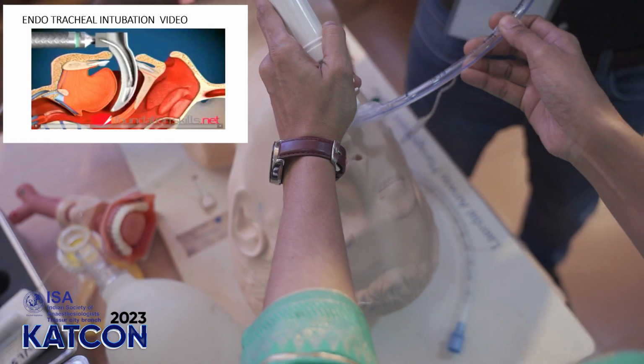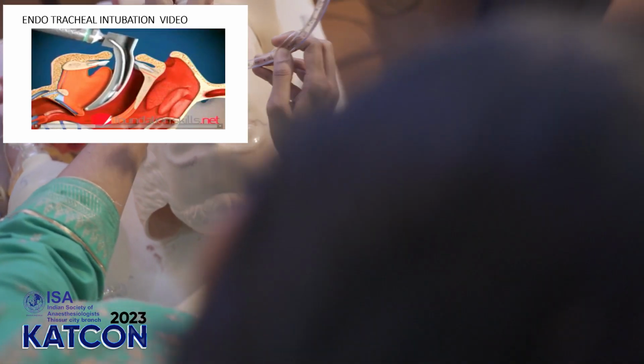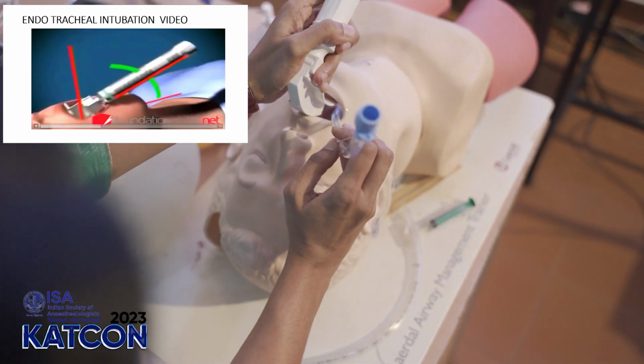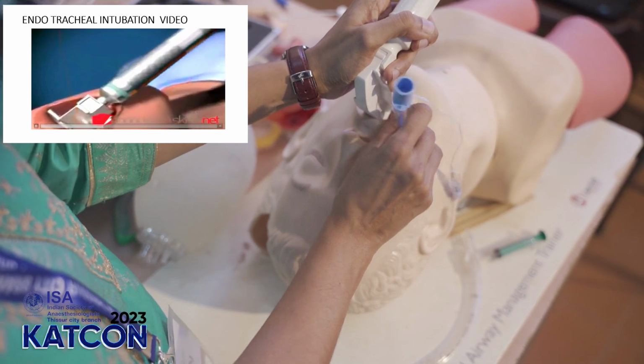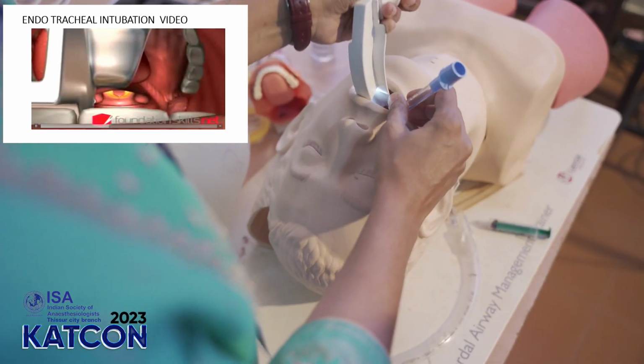Advance the tip of the laryngoscope blade into the vallecula between the epiglottis and the tongue. Once we see the epiglottis, we'll go to the base of the epiglottis with the handle of the laryngoscope pointing away from you at 45 degrees, and we lift the laryngoscope upwards and away to lift up the tongue and epiglottis to display the vocal cords and the laryngeal opening.